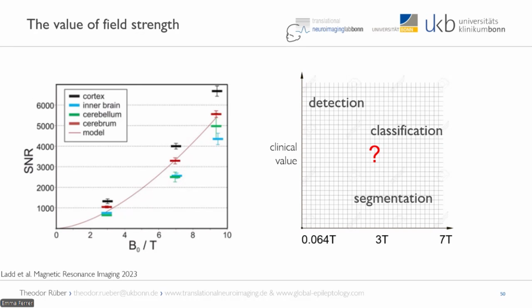There's definitely big value of the 7T as we find it in epilepsy. And I'm telling you this because I think it's maybe paradigmatic for or generic for other pathologies as well. I think this is a really interesting use case in epilepsy.